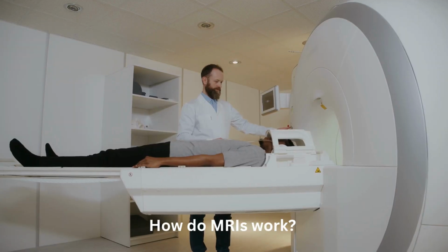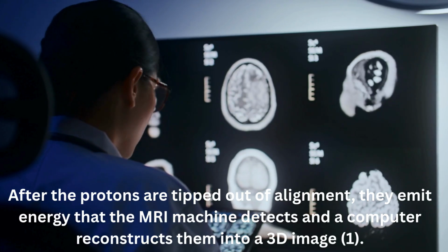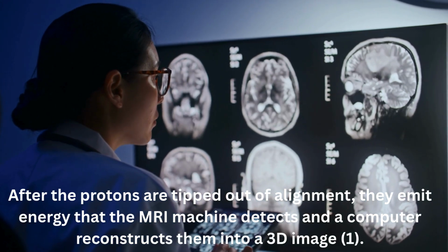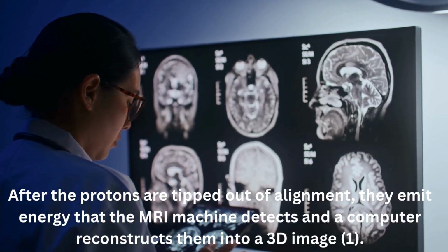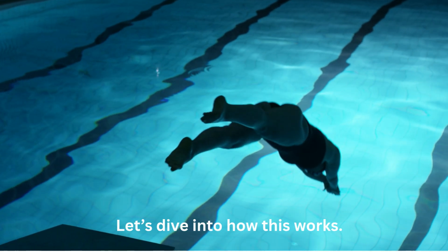So how do MRIs work? An MRI machine uses a powerful magnet to create a strong magnetic field around the patient, aligning the hydrogen-proton molecules in their bodies. After the protons are tipped out of alignment, they emit energy that the MRI machine detects and the computer reconstructs them into a three-dimensional image. Water molecules are abundant in the body, which makes hydrogen protons ideal for producing detailed images of our tissues. Let's dive into how this all works.